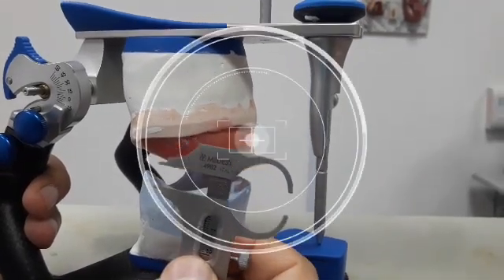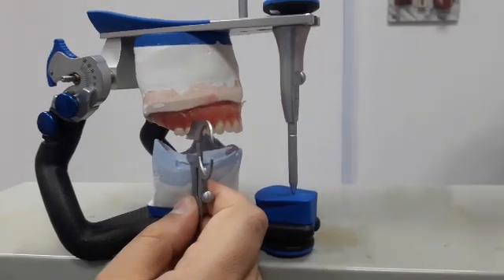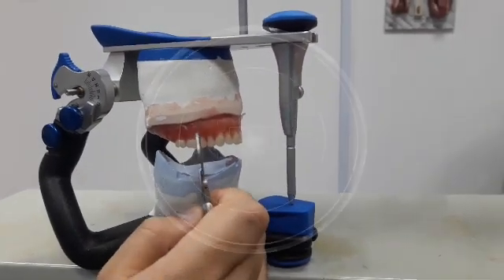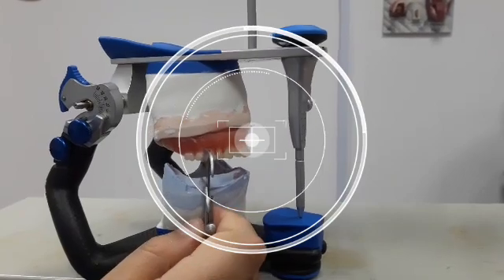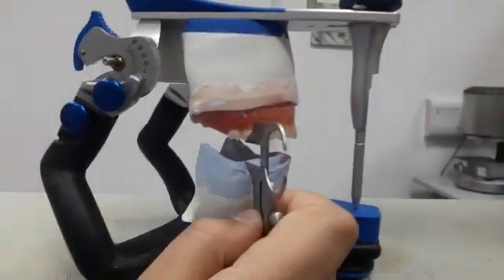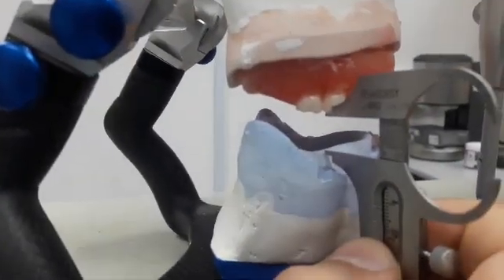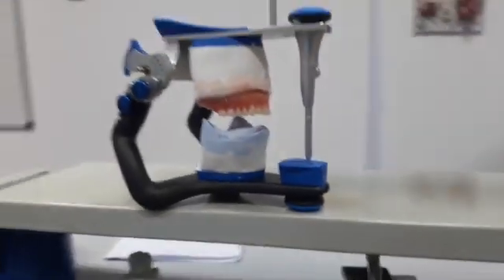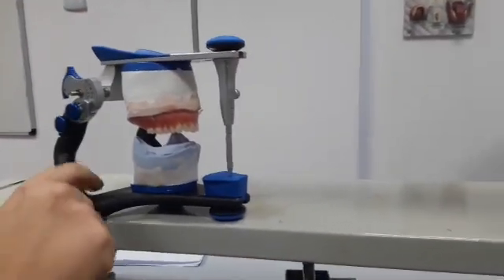Here it is about 9 to 10 millimeters. Posterior, it is about 12 millimeters. After measuring this space, this space will accommodate the restorative or the prosthesis that is going to be made.